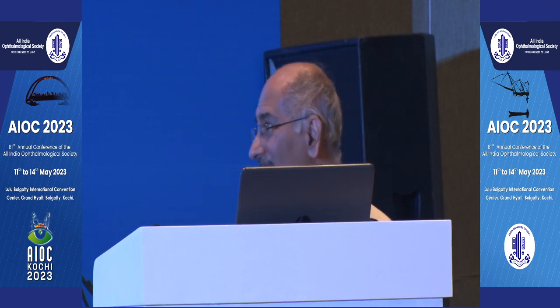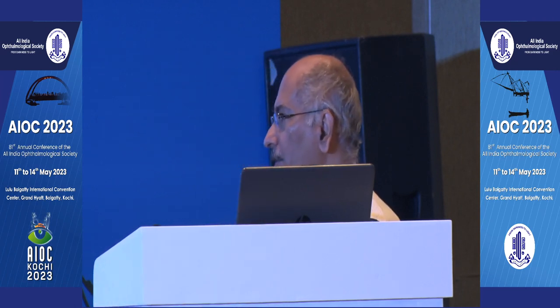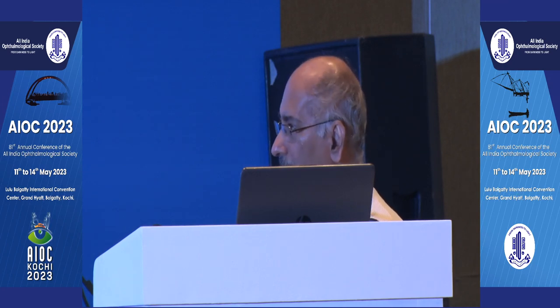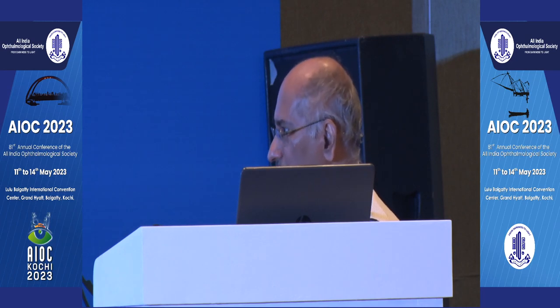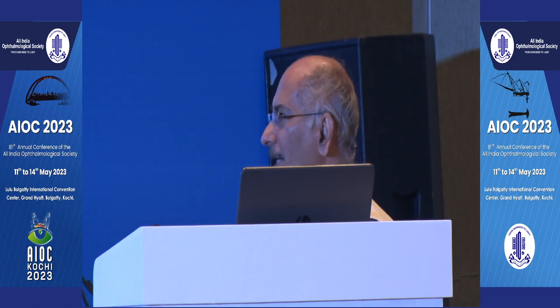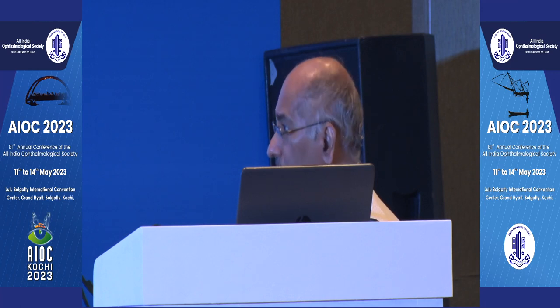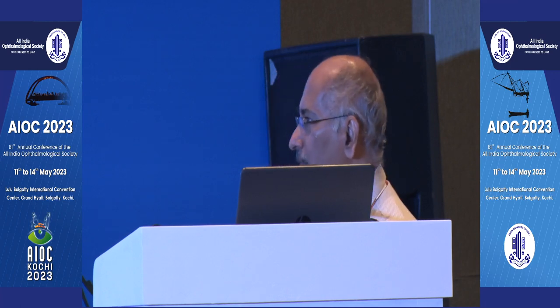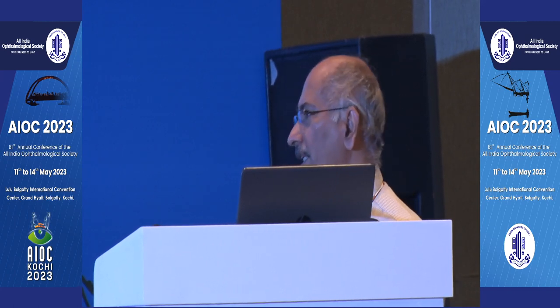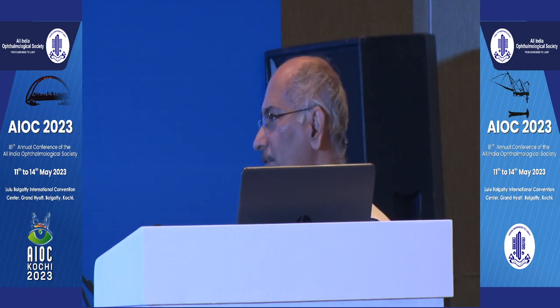Do you use methotrexate in these cases to prevent any further? No, I have not been using methotrexate, but I use triamcinolone at the beginning of the surgery to stain the vitreous. Some particles invariably remain. And sometimes in these bad PVR cases, I even inject intravitreally at the end of the surgery, even if I've put in oil. So they help to slow down the PVR process, the inflammation basically, or I may just inject deep posterior subtenon triamcinolone. I've found that to be useful.